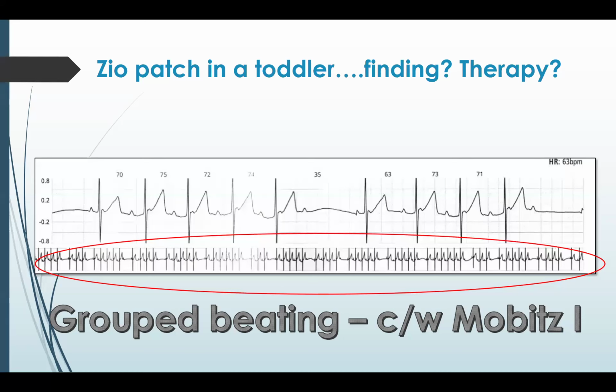And so if you saw that somebody had Mobitz 1, Christina, is there anything you would do about this? I'd want to see when it's happening, during the day or at night. If it's happening at night, especially in a young child or toddler, I would think it could be just due to a high vagal tone. In an older patient, it could be an athlete who is well conditioned, so you could see it as well. Yes, I think that's all correct.